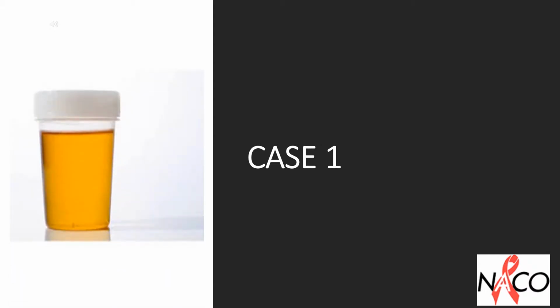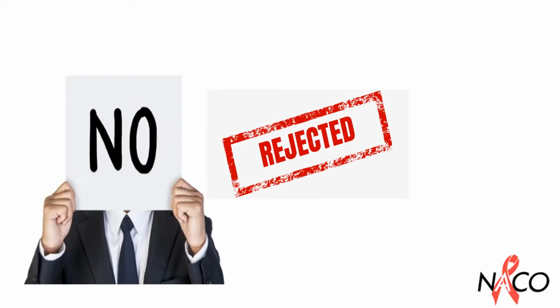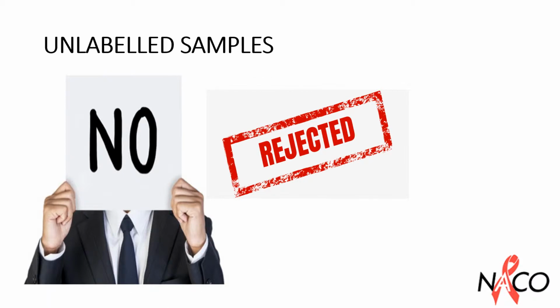To have a comprehensive understanding of this critical and important topic, which can affect test results eventually, let's go through a few case studies. A laboratory has received a requisition for urine culture and sensitivity in an unlabeled container. Would you like to test the sample or not? The answer is no. The laboratory should reject the specimen of urine which has been obtained in an unlabeled container.